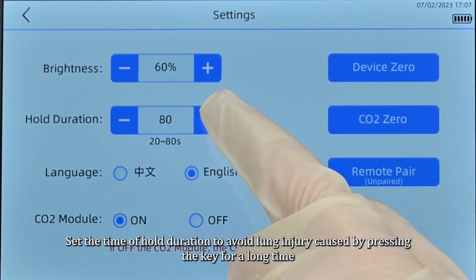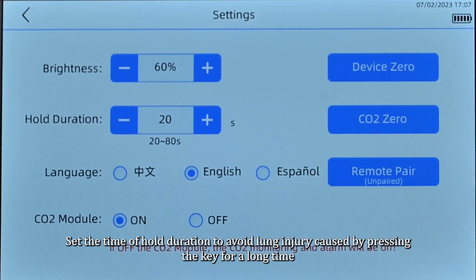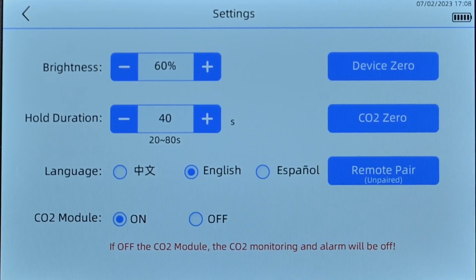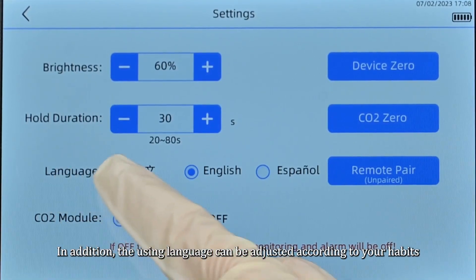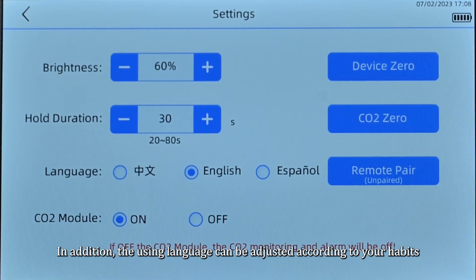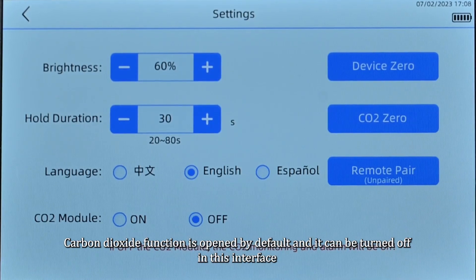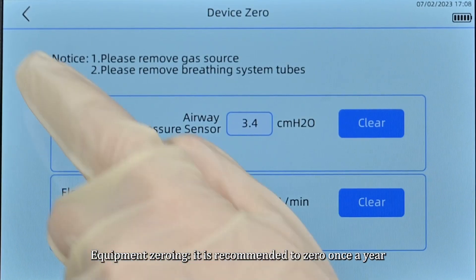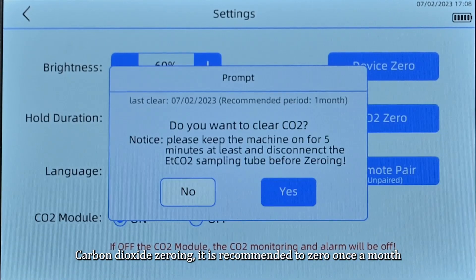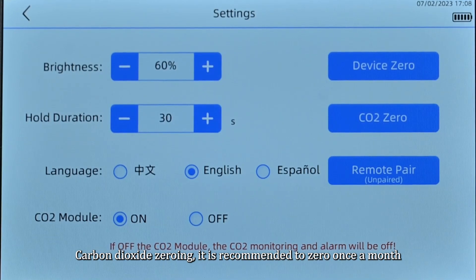Set the hold duration time to avoid lung injury caused by pressing the key for too long. The display language can be adjusted according to your habits. The carbon dioxide function is open by default and can be turned off in this interface. Equipment zeroing is recommended once a year; carbon dioxide zeroing is recommended once a month.